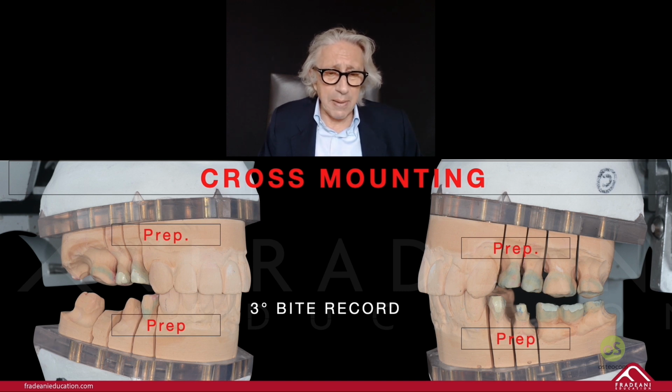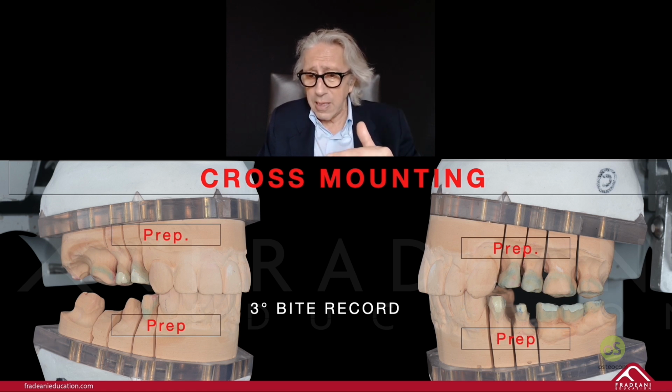Some people many times ask me, is it not sufficient to have one like that between the 2 preparations? Not if you want to copy the occlusal setup that we have done on the mock-up and the speed curve, etc. So you need to know how to divide the space between the upper posterior arch and the lower posterior arch, because it can be occupied 50% and 50% or 70% and 30%. So how can you know? Just having copied the mock-up that you have done before.